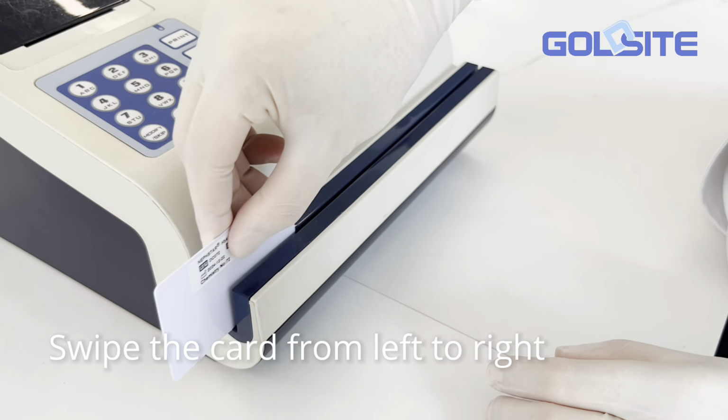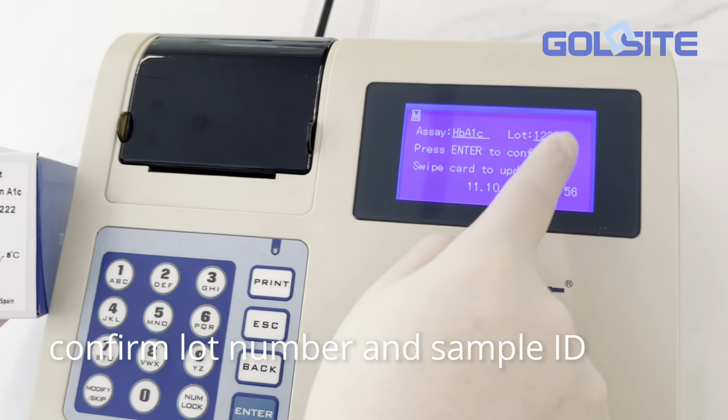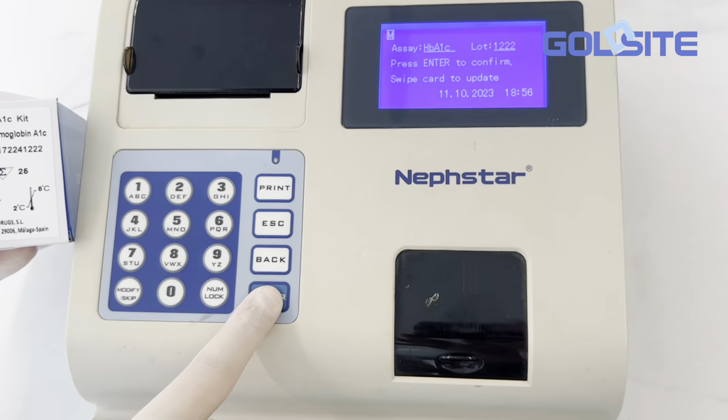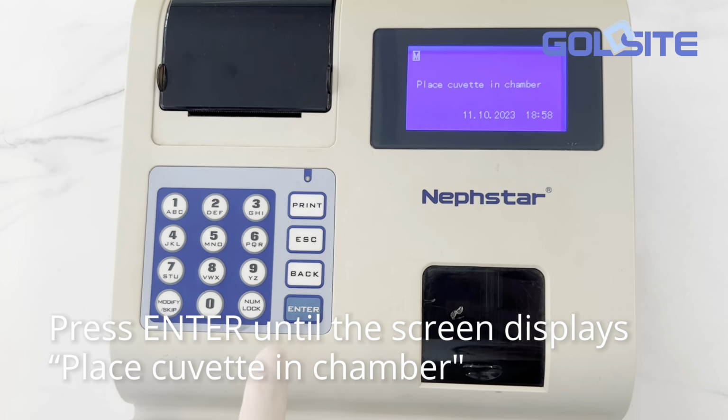Swipe the card from left to right. Confirm lot number and sample ID. Press Enter until the screen displays Place cuvette in the chamber.